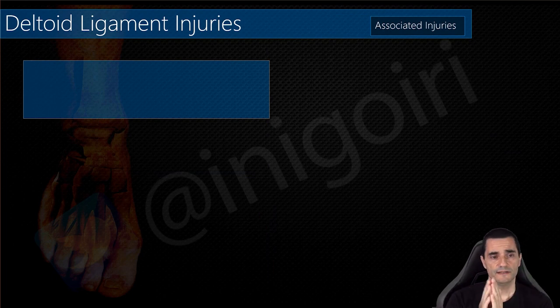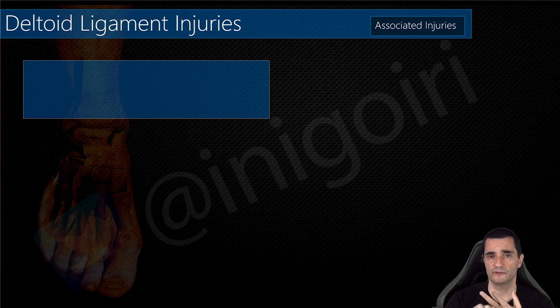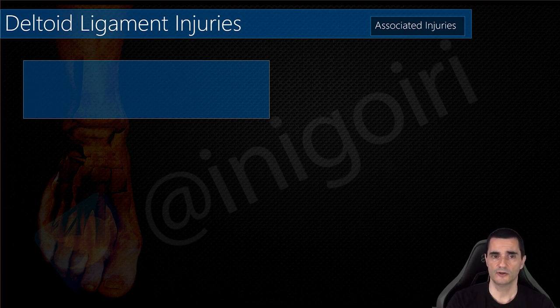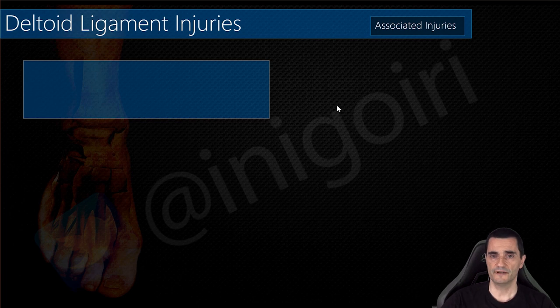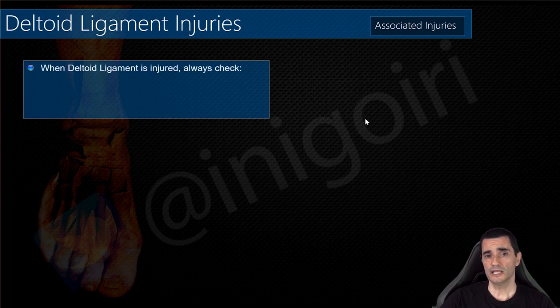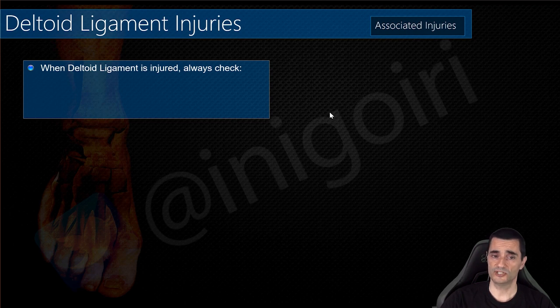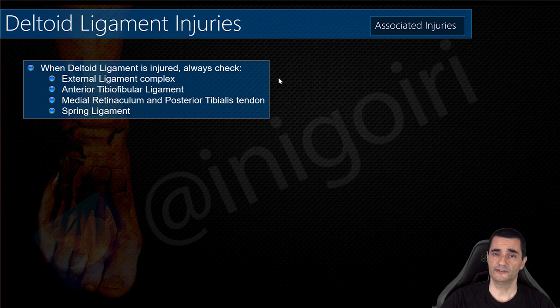So, you can find injuries of the deep layer — the posterior tibiotalar and anterior tibiotalar components — and of the superficial layer — the tibiocalcaneal, tibiospring, and tibionavicular components. All six components may be affected and can be assessed very accurately with ultrasound. When we detect an injury of the deltoid ligament, we must also check the external ligament, anterior talofibular ligament, anterior tibiofibular ligament, medial retinaculum, posterior tibialis tendon, and the spring ligament — all these structures must be assessed.